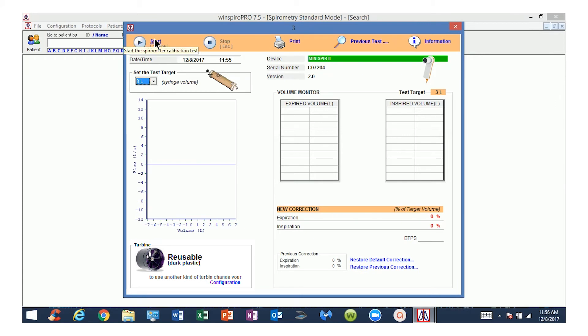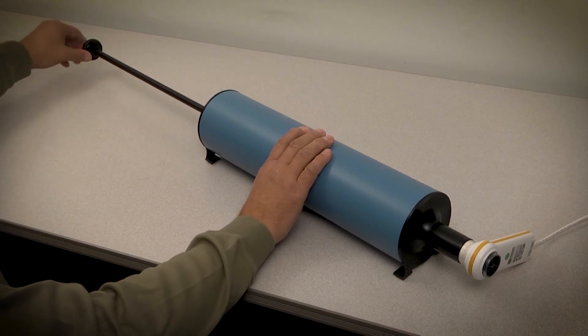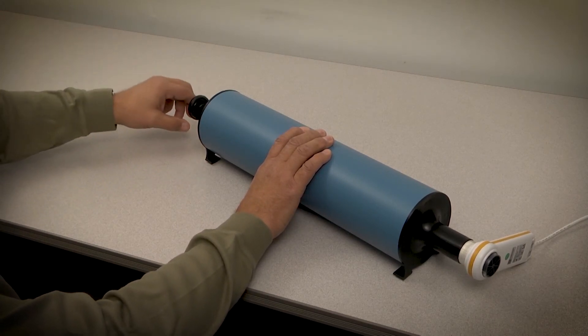Always check to be sure that you have a tight seal and that no air is leaking at the syringe or the turbine. If the results are still outside of the three percent range again, redo the test for a third time, again checking to be sure you have a tight seal and that no air is leaking. Be sure to pull and push the syringe piston all the way to the built-in stops in each direction.